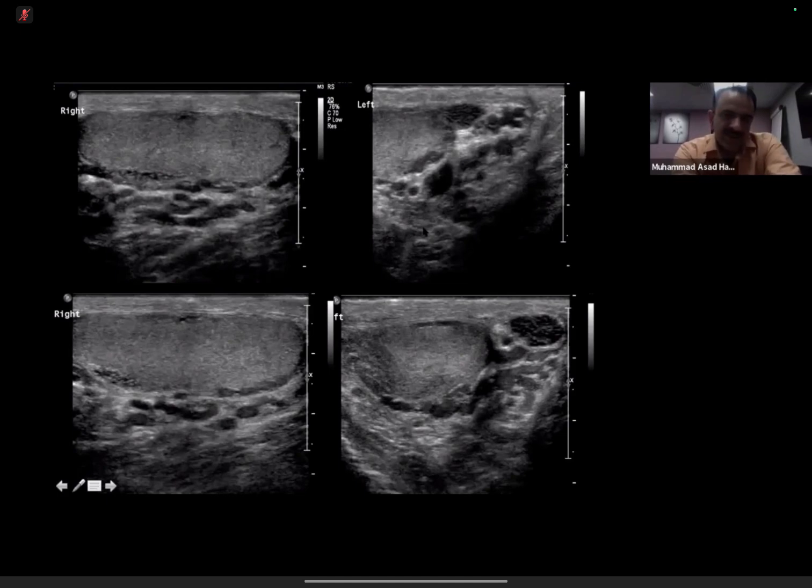So unlikely that it is getting obstruction because of any malignancy in the proximal course. So reflux is actually a good sign. It is reassuring. On the other hand, if it's non-refluxing, then it is usually an external mechanical obstruction to the flow, and that points out that there's some sort of malignancy involved.